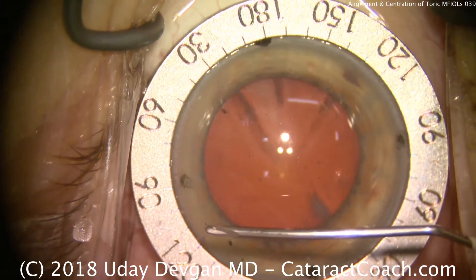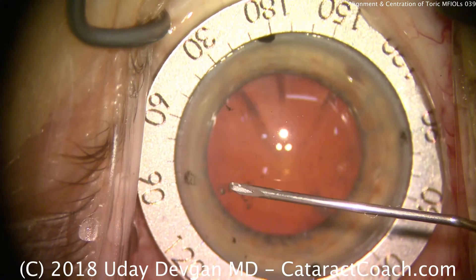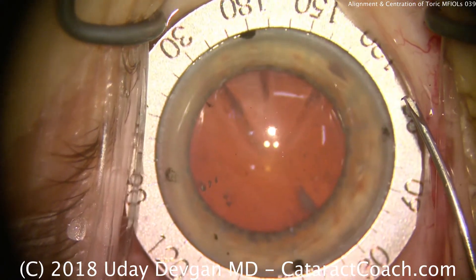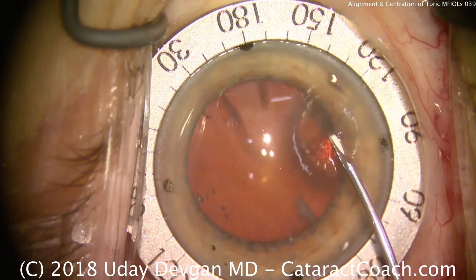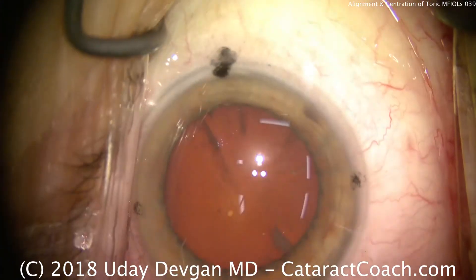Alignment and Centration of a Toric Multifocal Lens. We're marking the steep axis here at about 100 degrees, using a cystotome to make marks in the anterior cornea. These marks will be easily visible throughout the surgery and will allow us to align the toric lens to that axis.